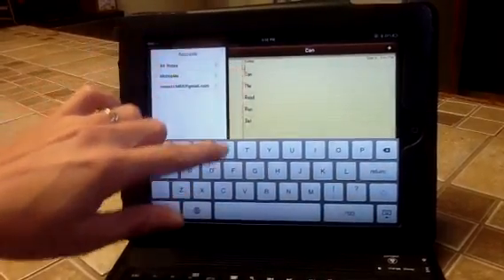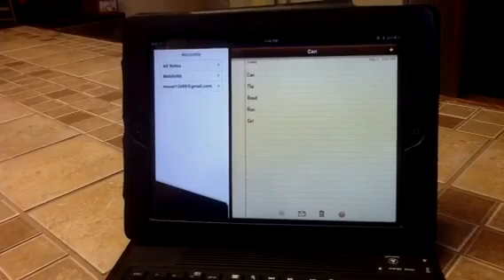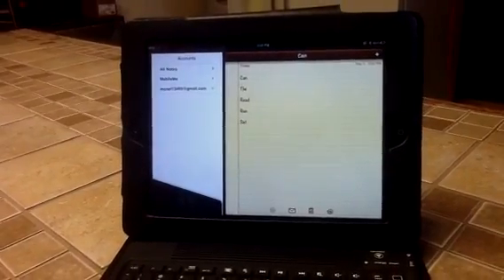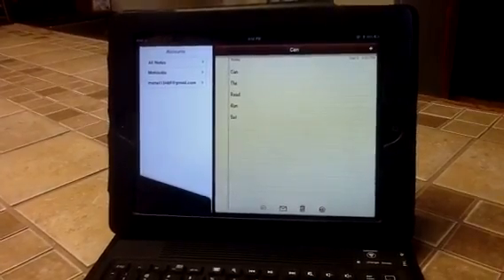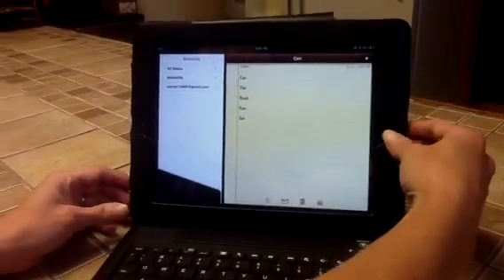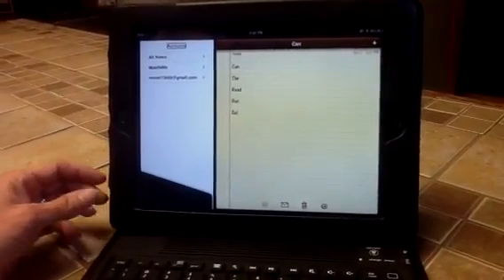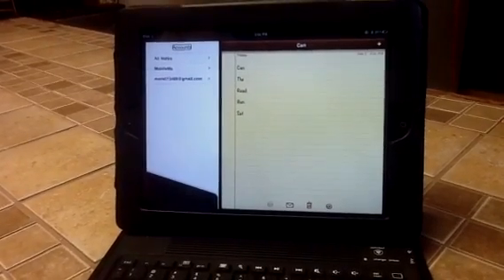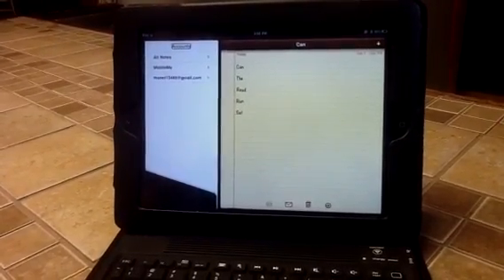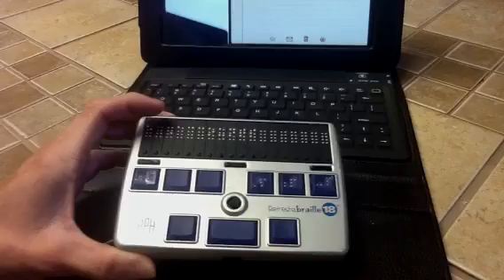Now that I'm finished, I'm going to move my cursor back up to the beginning and turn off my keyboard. Because I've set the triple click home as a toggle feature to turn VoiceOver on and off, I can simply turn on the VoiceOver feature by hitting my home button 3 times. 1, 2, 3. VoiceOver on. Landscape. Home button to the right. Notes. Accounts. You'll notice that VoiceOver turns on, and in addition, my Braille display also starts displaying Braille, or whatever the VoiceOver cursor is reading.